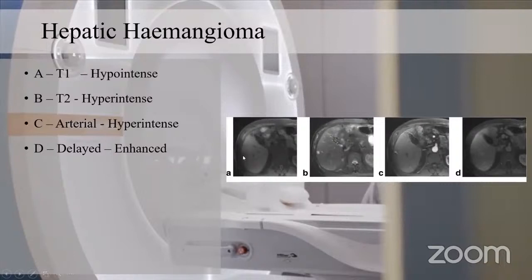Here the lesion is very hypointense compared with the liver parenchyma, and on T2 it will be hyperintense relative to the liver parenchyma. It will be hyperintense, but not as hyperintense as fluid or CSF. It will be less hyperintense compared with the CSF.